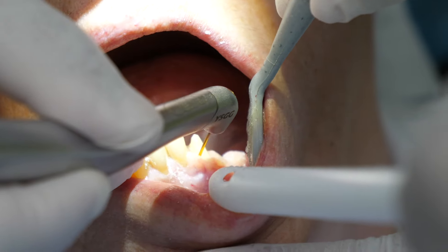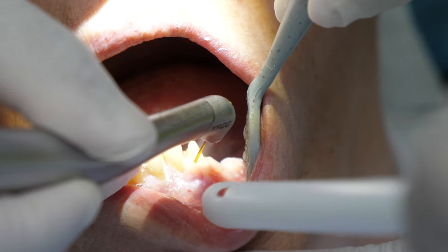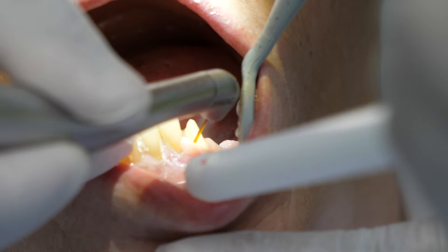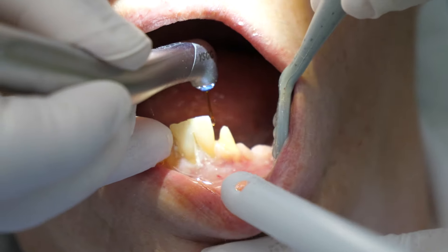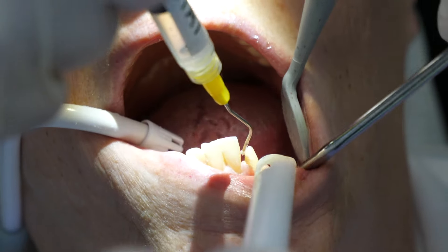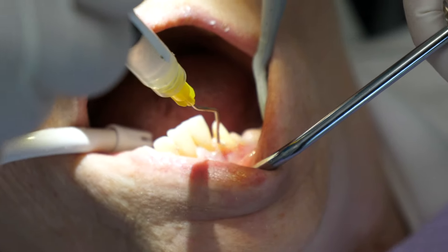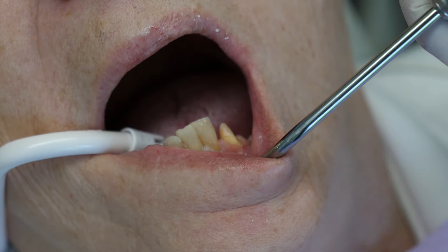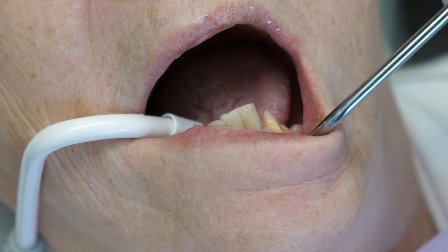Next, they will either use a cord to pack around the gums of the tooth, or some offices may use a laser like you see here. The laser is actually troughing around the gum areas of the tooth, which takes the place of cord packing. They might also place a material called viscostat around the gums to prevent any bleeding, although the tissue removal with the laser in this case prevented initial bleeding. You don't see much blood when you use lasers — it's pretty cool. Either way, the viscostat material prevents any additional bleeding.